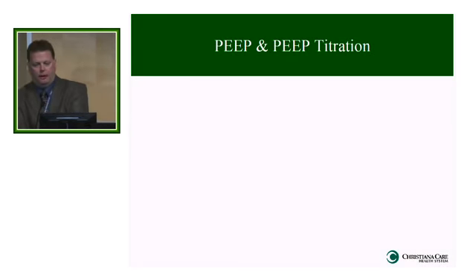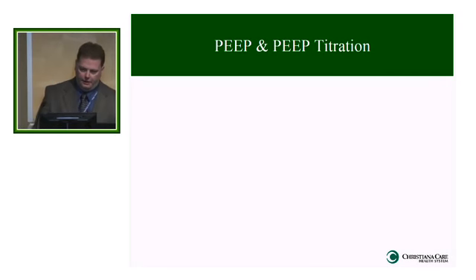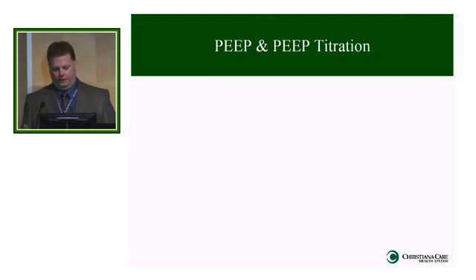So we're going to start talking about PEEP and PEEP titration. And you heard Dr. Abashi and others mention that gosh, PEEP's been around long enough. Why the heck don't we know what to do with it? And I think, quite frankly, we really don't know what to do with it. We think that probably more than 5 in ARDS patients is good, and a lot of experts will tell you 15 or above the lower P flex. But again, we have not proven that is going to reduce mortality in patients. In fact, there's been 2 ARDSNet studies, and the one looked at a lower scheme, one looked at a higher scheme, and in reality, there was no evidence about which one would save lives.